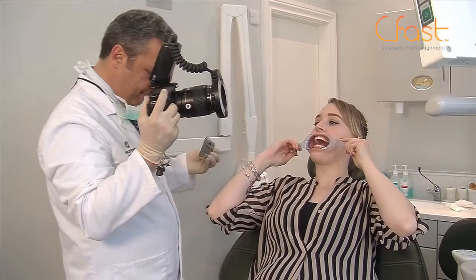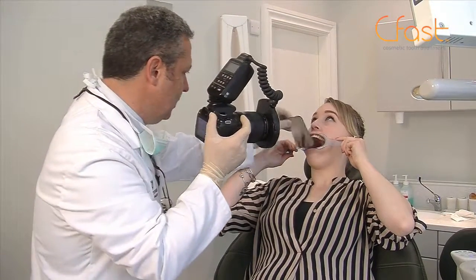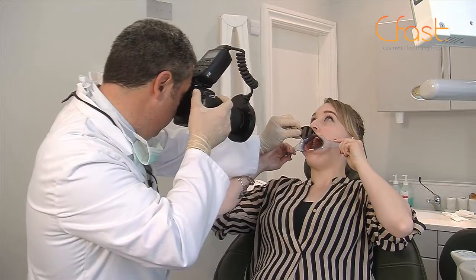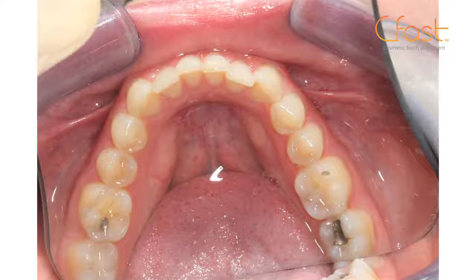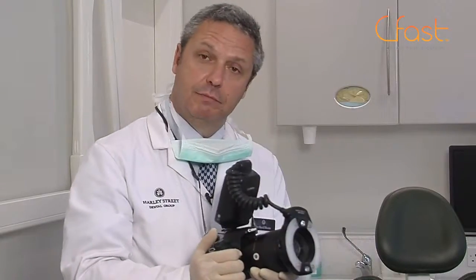And exactly the same. So, big wide mouth for me now, Heather. Relax your tongue. Now this time I want you to pull these forward. That's brilliant, thank you. Perfect, big wide mouth. That's it, relax. You can take them out. Well done. So, in summary, that's it.